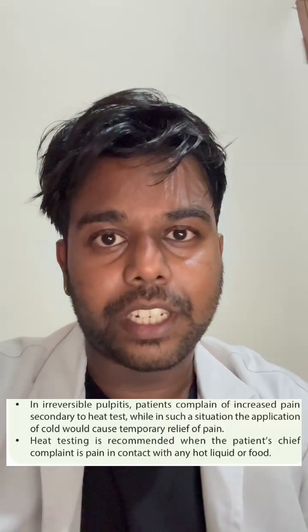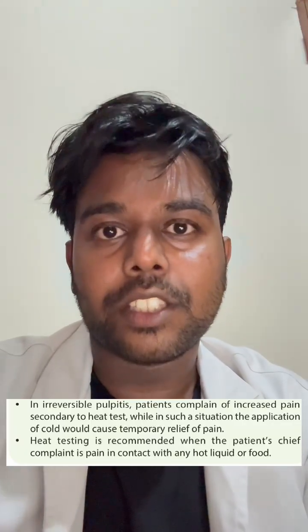Usually, the heat test is recommended when the patient's chief complaint is pain while coming in contact with hot food or hot liquids. And in cases of irreversible pulpitis, the patient complains of increased pain secondary to the heat test, and in such cases, the cold test helps to relieve the patient's pain. The most ideal way of performing a pulp sensibility test is a combination of the cold test and EPT.